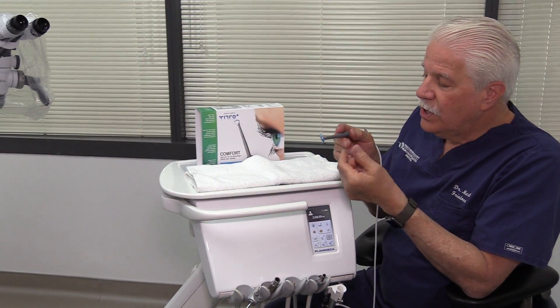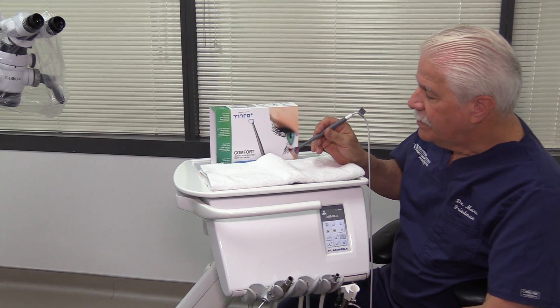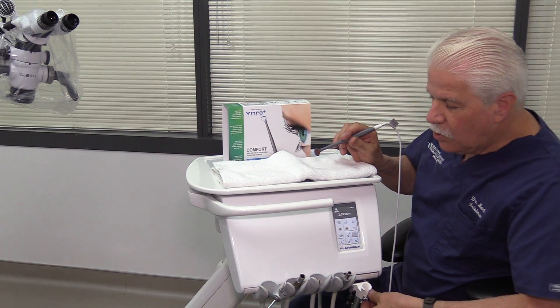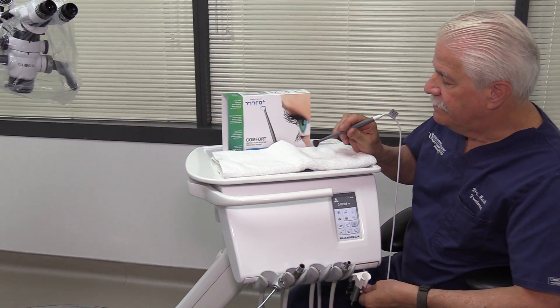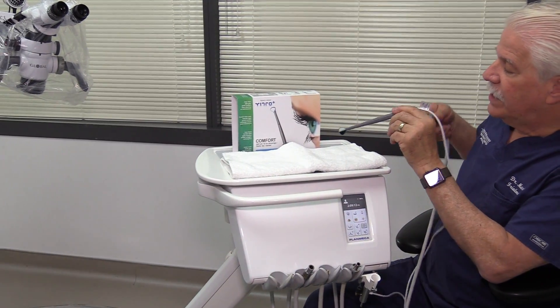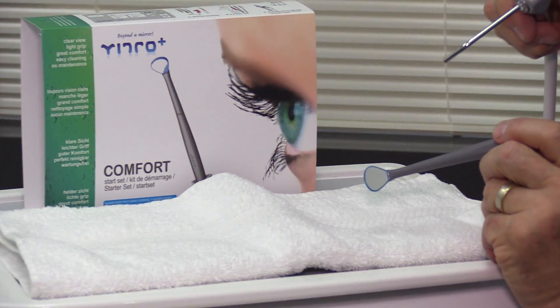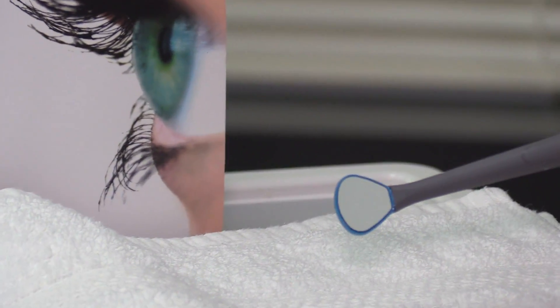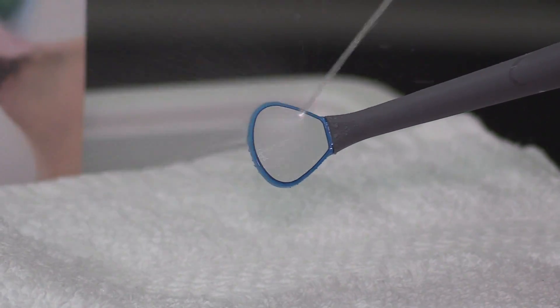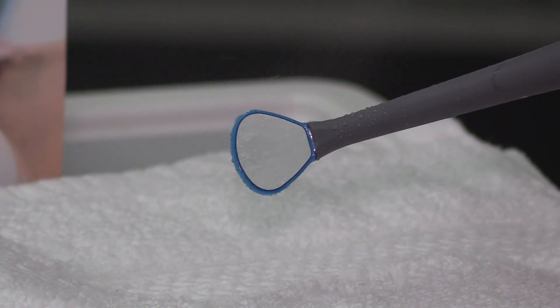Let me show you macroscopically a little bit how it works. We'll go ahead and turn the mirror on — I've got it on fairly low pressure, let me turn it up just a little bit. We'll take our three-way syringe, and if you can just zoom in on that mirror — can you see it pretty tight? We'll just pour a little water on, and you can see that the water doesn't stay on the mirror for a nanosecond.